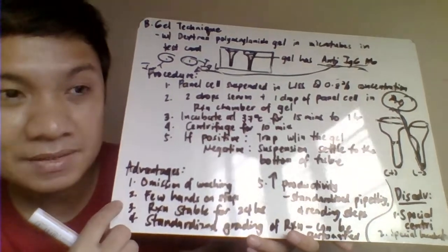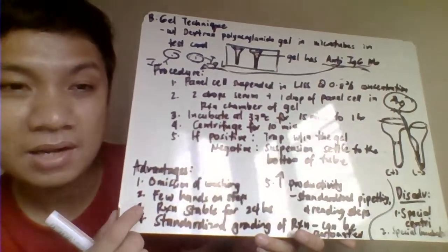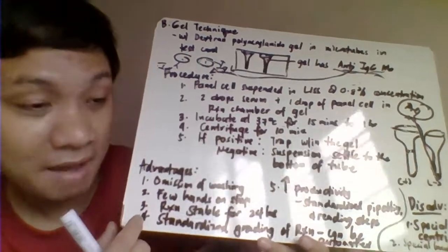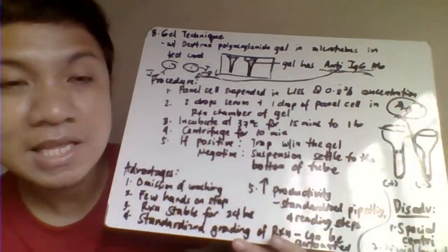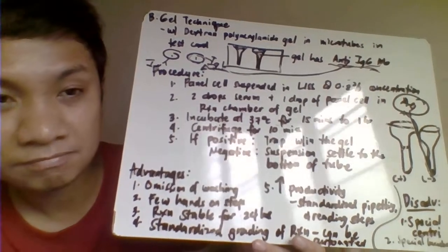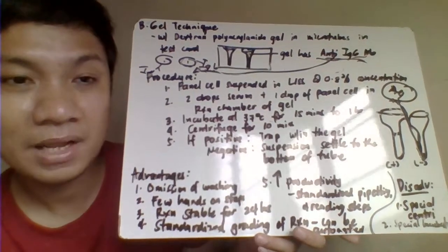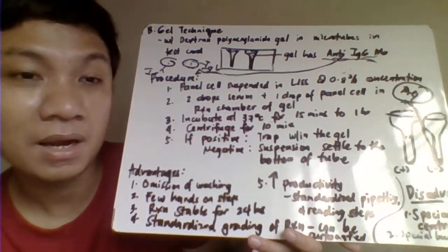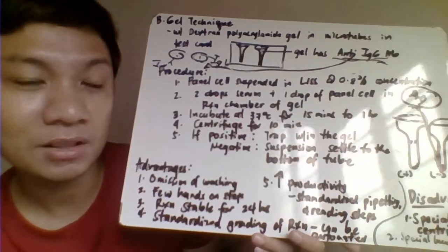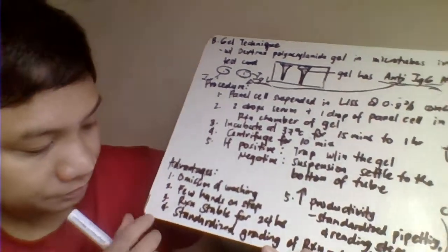So, pag ikaw lang mag-isa, hindi ka sure, so wala kang mapagtanungan. Whereas, pag 24 hours, okay, pag dumating ang ka-endorse mo for the next shift, so you could ask them. At the same time, you don't need to really be in a hurry to interpret the result, not unless sobrang stat or immediate ang antibody panel identification. Most likely kasi stat naman usually yung mga ganito because the patient is waiting for the blood transfusion naman.